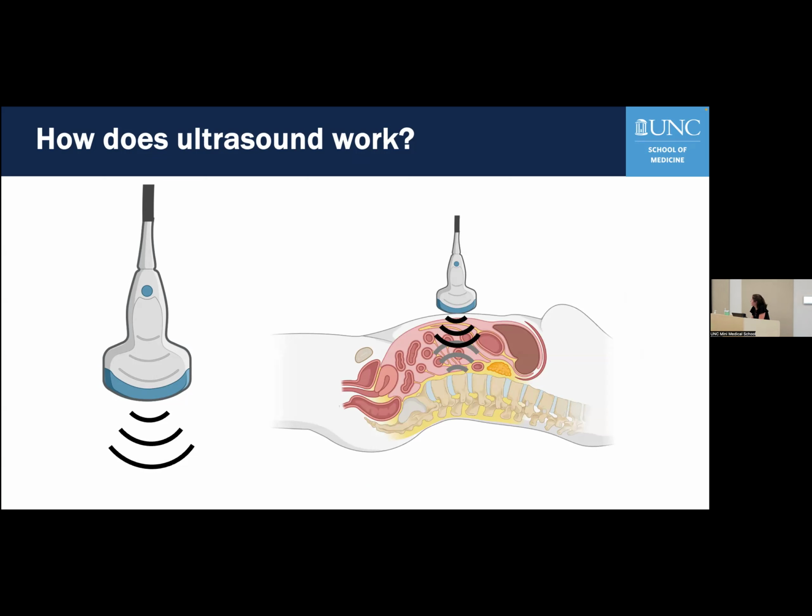Another really great thing about ultrasound is we can actually move this device to get different pictures in real time. You might have seen this in movies or wherever you've seen an ultrasound, where we can pivot that device to get different pictures and essentially get a 3D image.